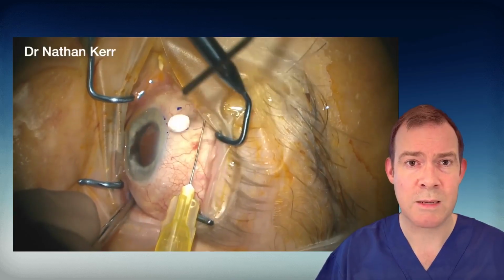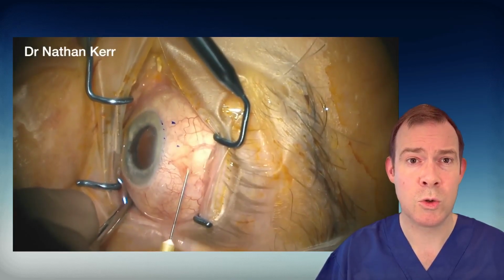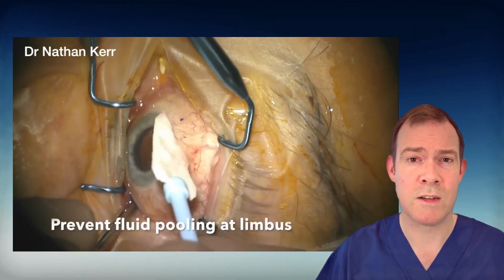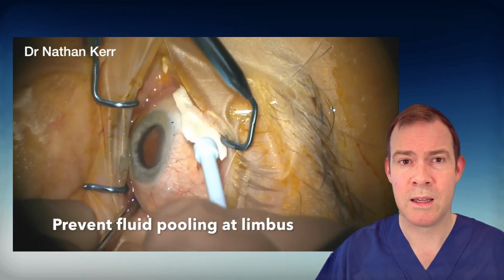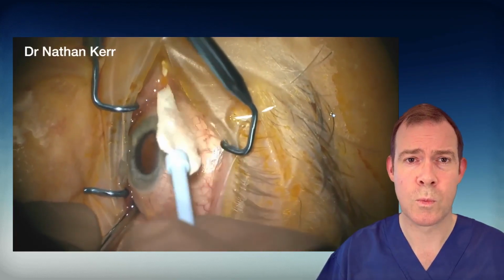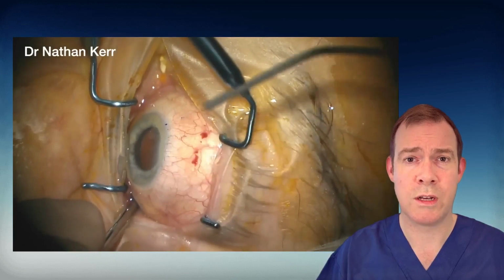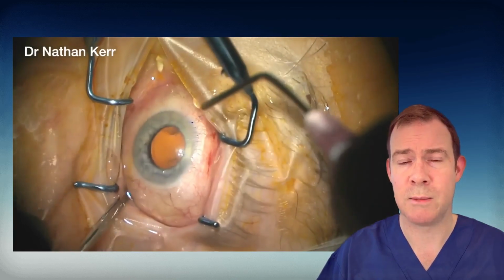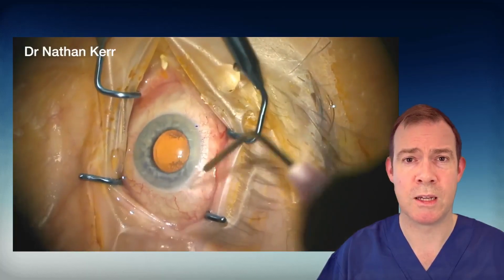If you are using antimetabolite here, you need to ensure that it does not pool at the limbus to help avoid the creation of an avascular bleb. Here, sweeping the fluid away from the limbus, and then washing with BSS to remove any antimetabolite from the corneal surface.